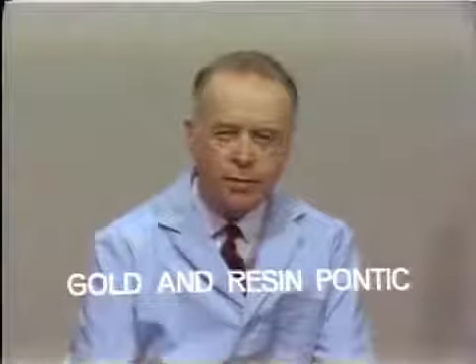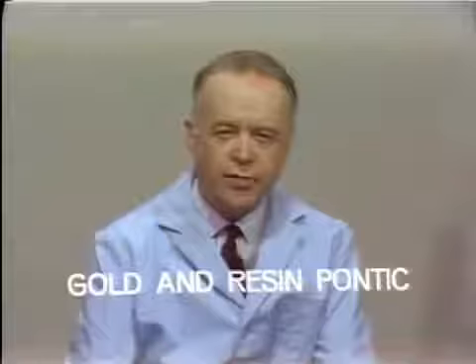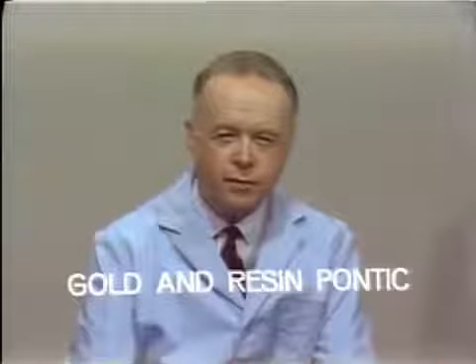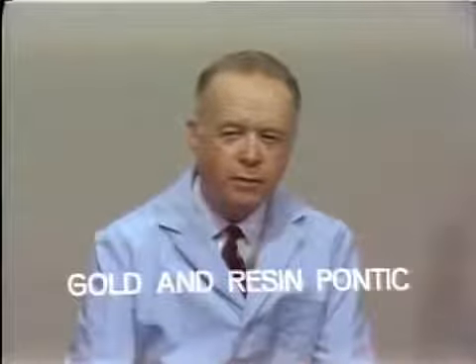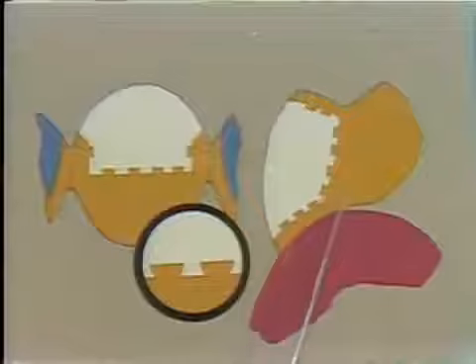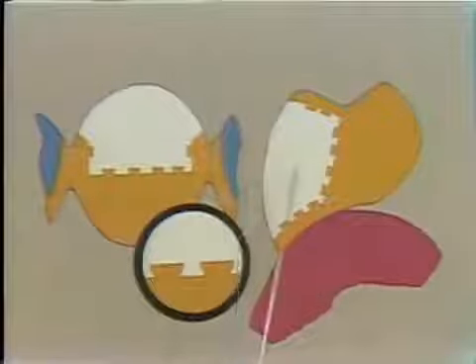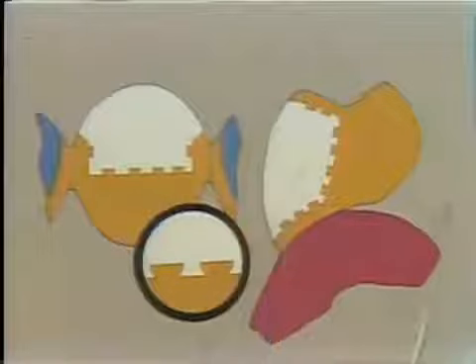The modern tooth resins have good color stability and good resistance to abrasion, and they make very useful and satisfactory facings for bridge Pontics. The typical relationship of the gold and resin of a bridge Pontic is seen in this diagram here. This represents a bicuspid Pontic with a ridge-lap relationship to the mucosa. This would be the buccal surface with the resin facing here. This is the lingual surface with the gold backing and occlusion here.